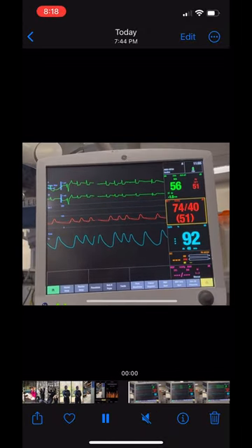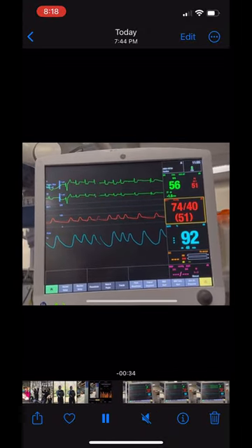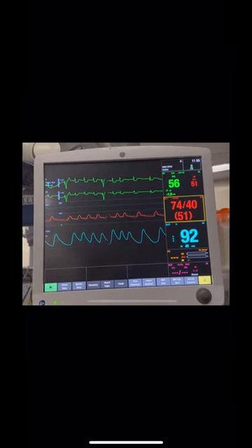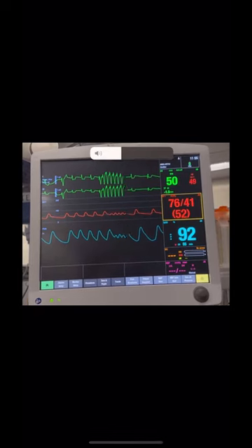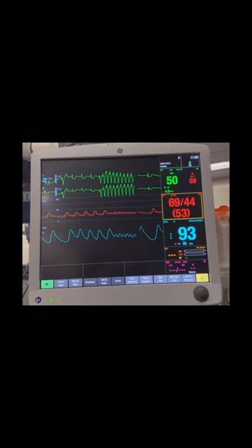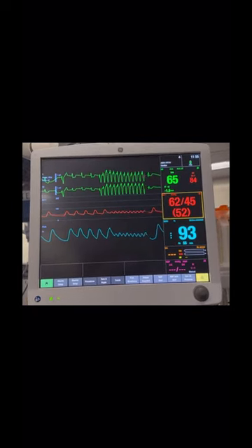This video demonstrates a patient going into ventricular tachycardia. It's regular and monomorphic.